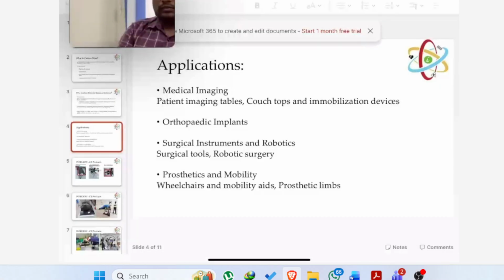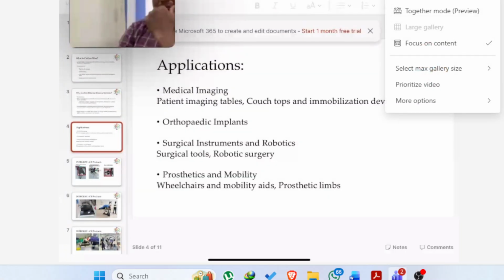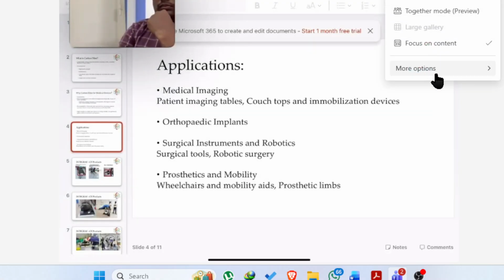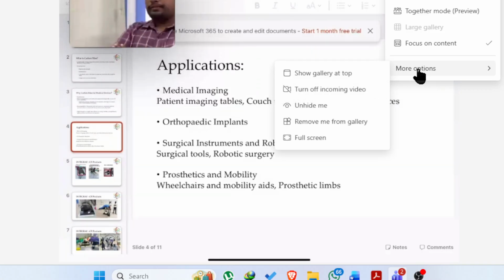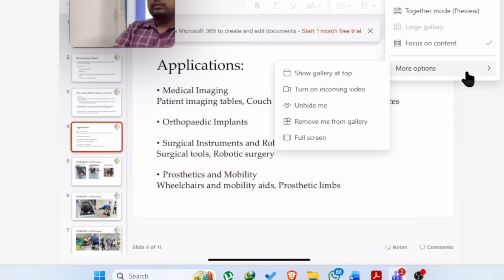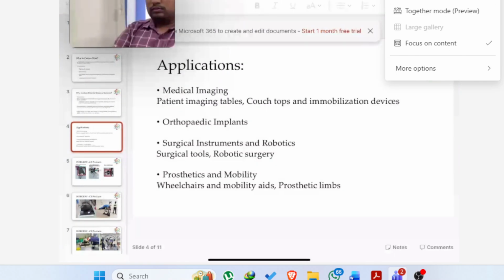So these are the two technologies available for treating all types of cancer. To treat, they have a radiation delivery system, but where will we position the patient? We position them on tables. So how is the table made and what is present in the table? The table has up and down movement, sometimes longitudinal sliding for moving the patient front and back to wherever I want to give radiation or position the C-arm. With that, we use hydraulic or motorized actuators to do the up and down movement, sliding and tilting of the table.